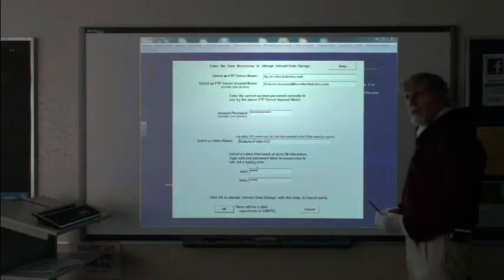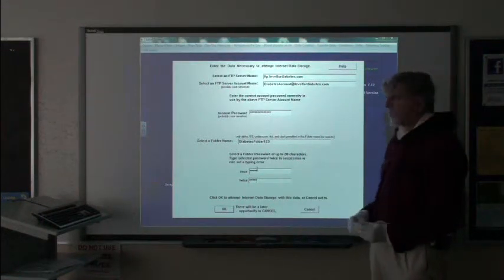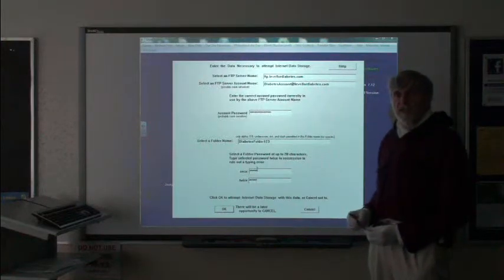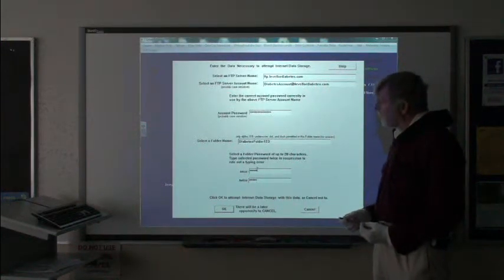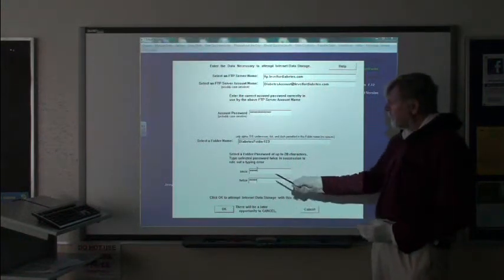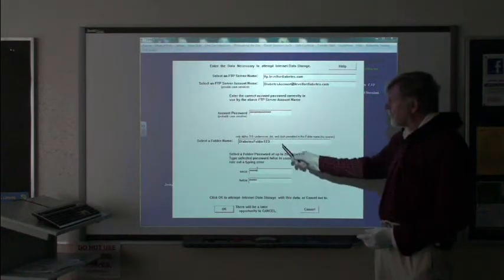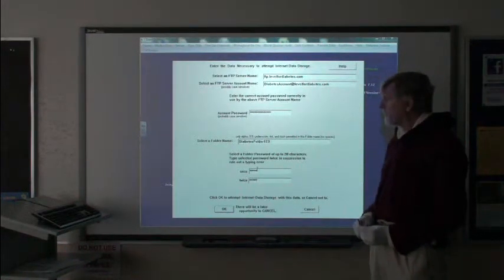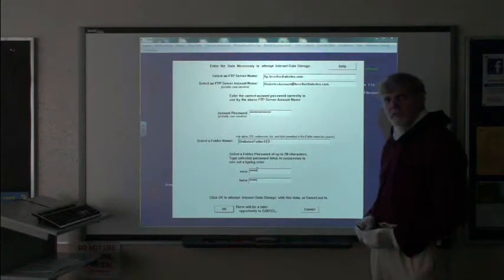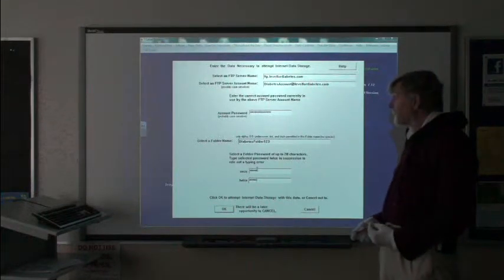The purpose of the password is not that you're worried about some of the other patients of this doctor seeing your data. They probably could be less interested. It is so that your data does not get mixed up with another patient. If you did not have a good firm password to protect it, then another patient could also join this folder and their data would get mixed up with yours. So the purpose of having a folder password is not for secrecy, it's for orderliness. And it is very effective in that regard.